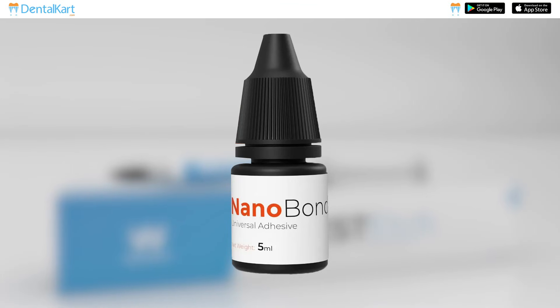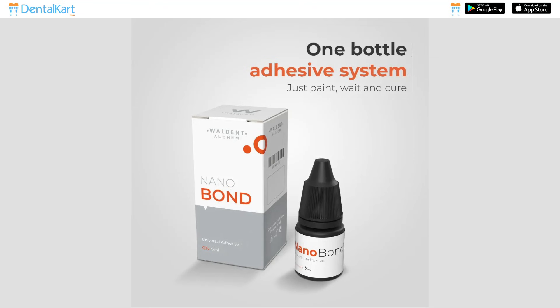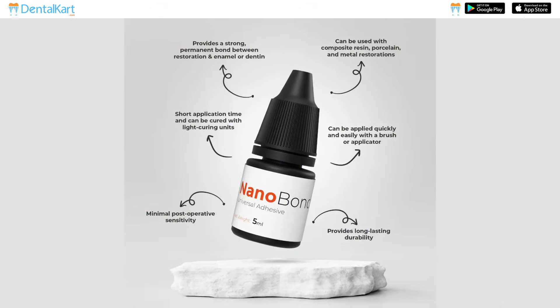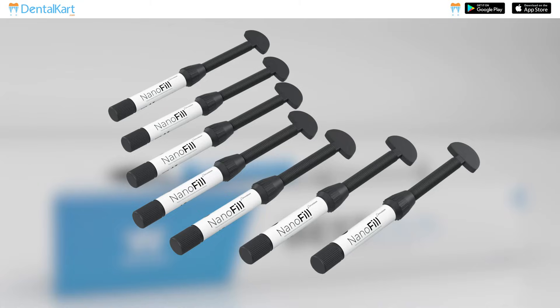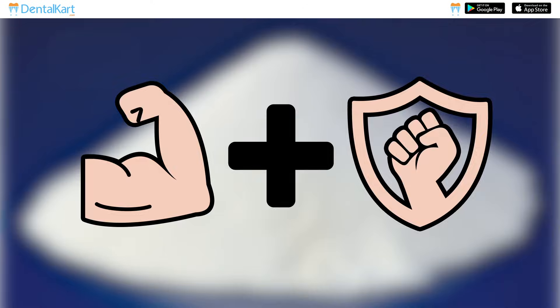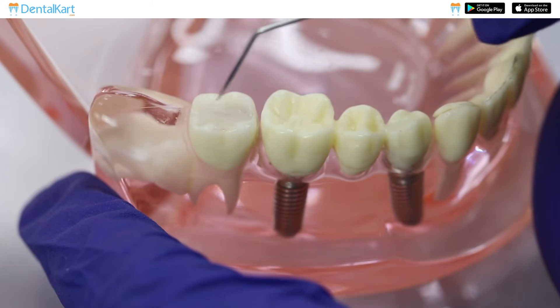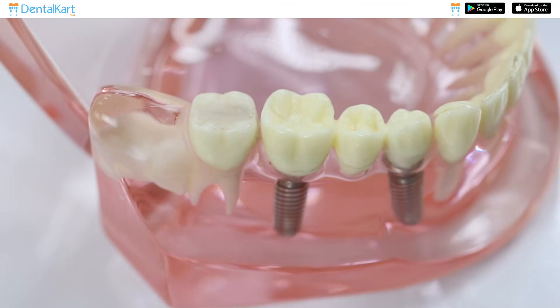The kit also contains Walden Nanobond, a light-curing 5th generation bonding adhesive containing both the aspects of a primer and a bonding resin in a single bottle. Walden Nanofill Zirconium Composite is made of zirconia, which is known for its high strength and durability, so the restoration done with this composite is more resistant to wear and chipping, ensuring long-lasting results.